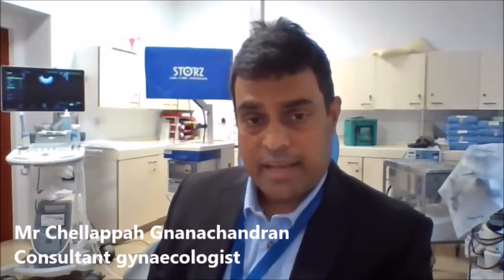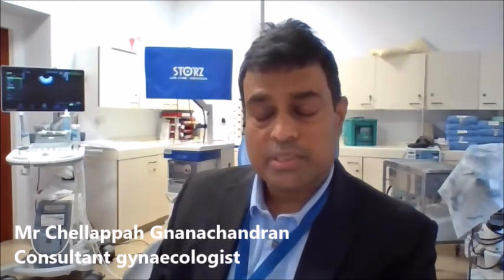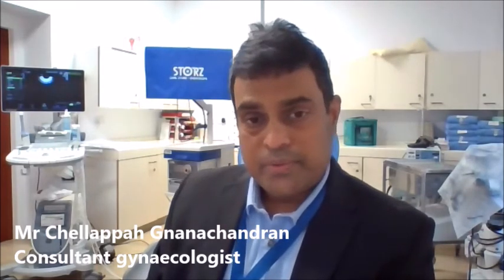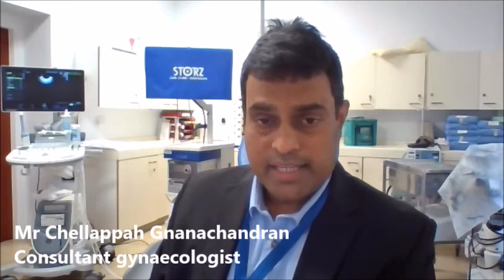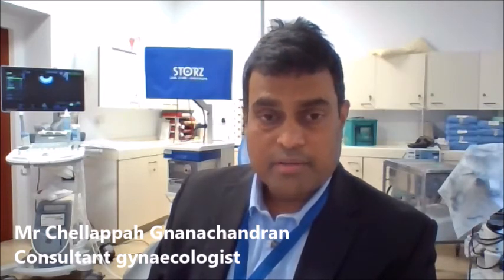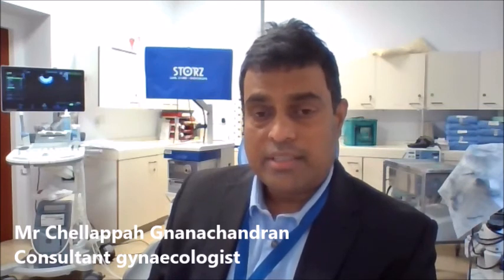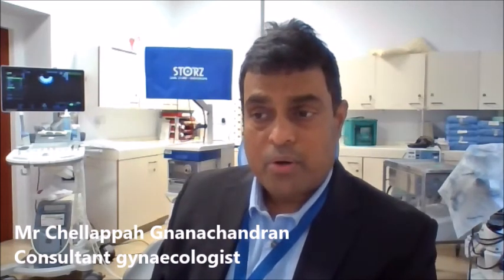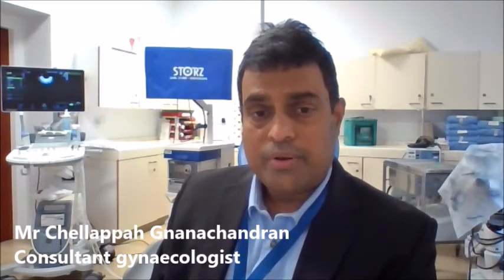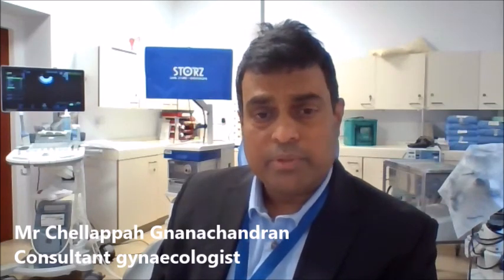There are no risks specifically for transvaginal scan compared to ultrasound scan. There's a theoretical risk of transmitting infection, but we use a barrier method every time and clean the probe; through the barrier, usually we use a type of condom. So the risk is not additional. But if you are scanning for early pregnancy with Doppler, it's better not to use the Doppler because Doppler has a heating effect, unless for a few minimal seconds.